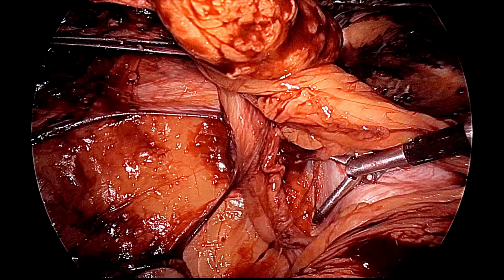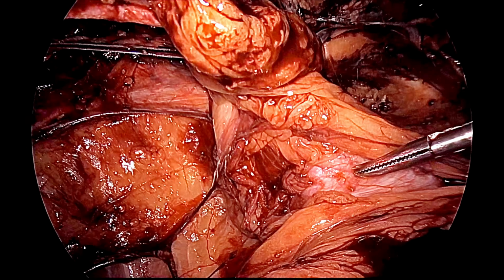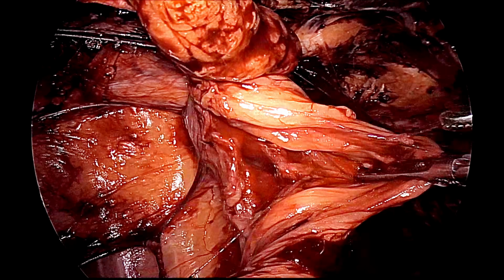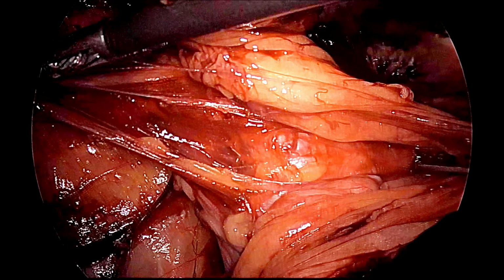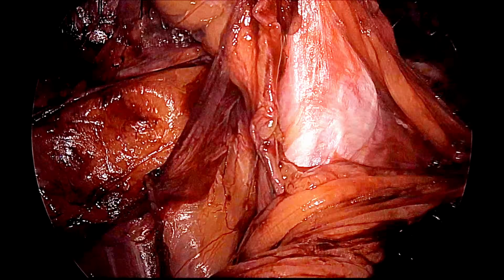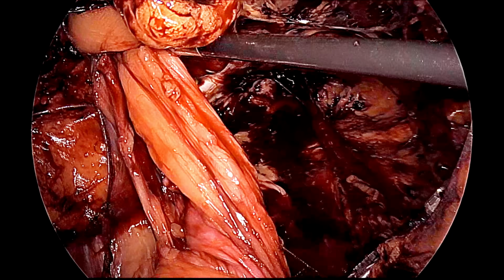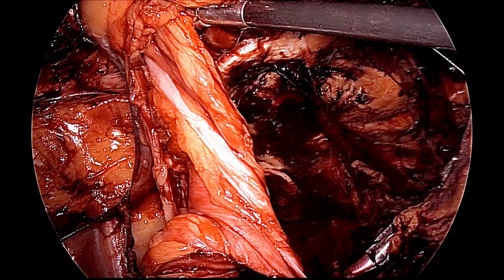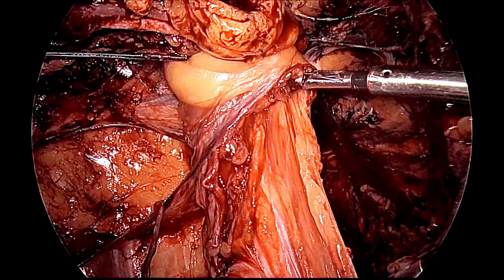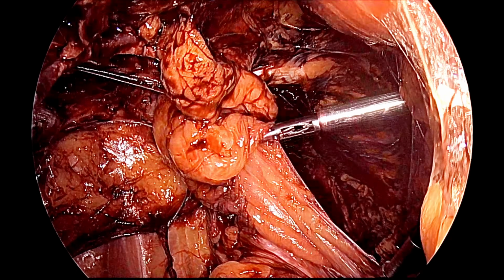So, we can see this is the spermatic vessel which is slowly being pushed laterally, and then holding the sac to pull it down. During this process, you have to be careful that blunt dissection is always preferred. You should avoid any hook or any energy sources. Here we can see that the sac is visible now, and this is a lipoma. So, this lipoma you can pull out, and that will help you to reduce the sac better.